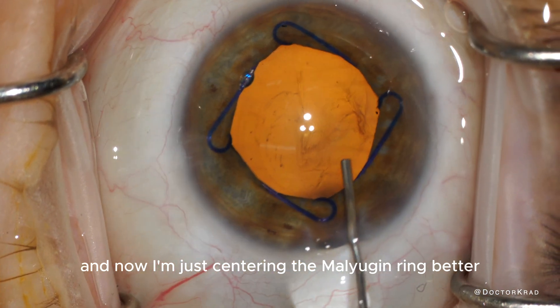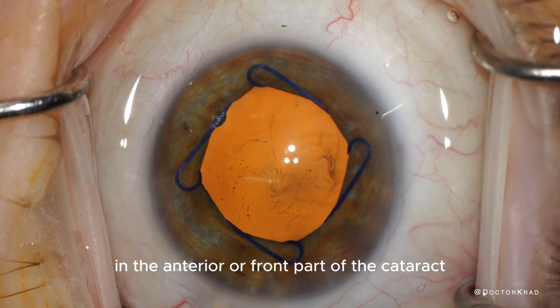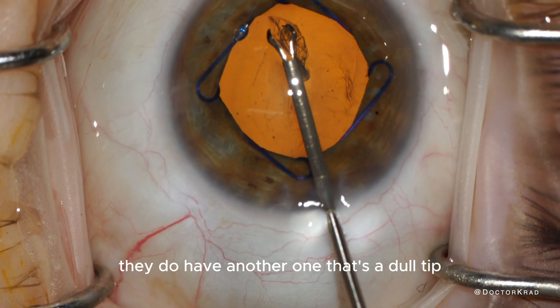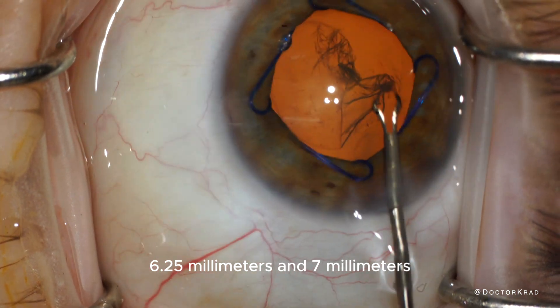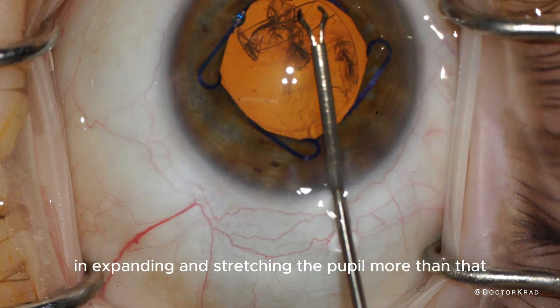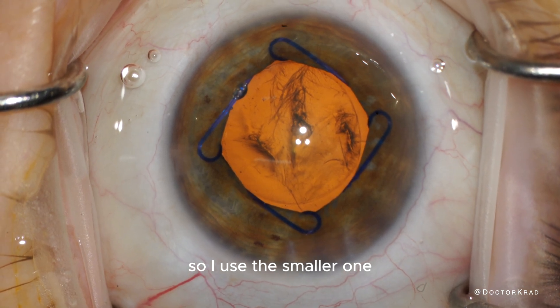Now I'm centering the Malyugin ring and I'm ready to proceed with the case as normal. I'm going to create a capsulorhexis, which is that opening in the anterior or front part of the cataract. The cataract is like a grape — it has a peel. This is the sharp tip capsulorhexis forcep by MST. The Malyugin ring comes in two sizes: 6.25 millimeters and 7 millimeters. I typically use the 6.25 — I don't see the point in stretching the pupil more than that. If an iris dilates to 6.25, I don't use a Malyugin ring. I think the smaller one is less traumatic.